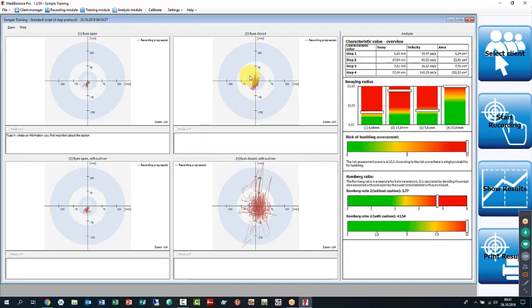And then we also see that the area that is being covered and the way the graph appears changes dramatically here. You also have a zoom factor on the bottom right of each of these graphs, and here it says zoom factor is 14, which means there's not much zoom going on. With very healthy patients, you might see 60, 80, even 120 as a zoom factor. So there's so little movement that we need to zoom in a lot to actually see the graph. We didn't have to do this here because the 4th graph is so pathological.